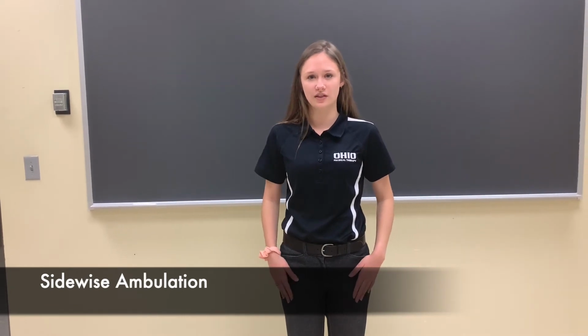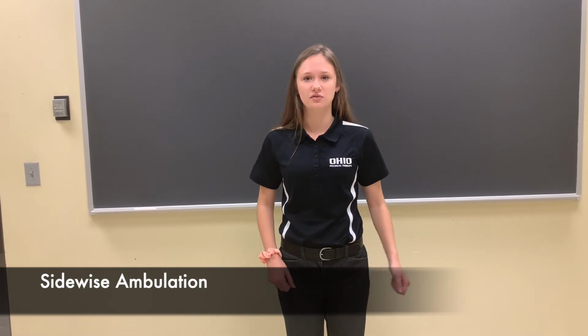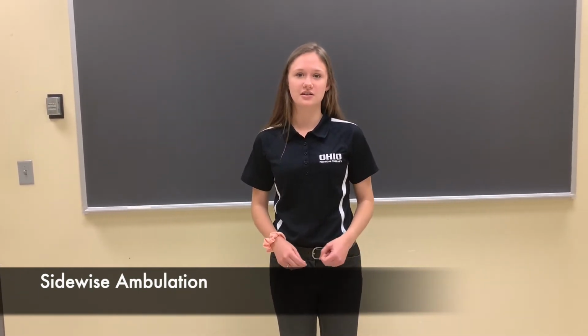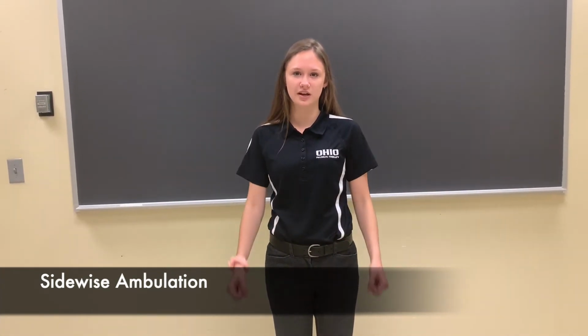For sidewise ambulation, for instance when moving to the right, the patient will first move the right limb, whether it is the partial weight-bearing or the unaffected limb, and then move the left leg and then move the walker in the direction of the movement. If it is partial weight bearing, for the limb that is being moved, the patient should place as much weight onto the walker with their arms as needed.